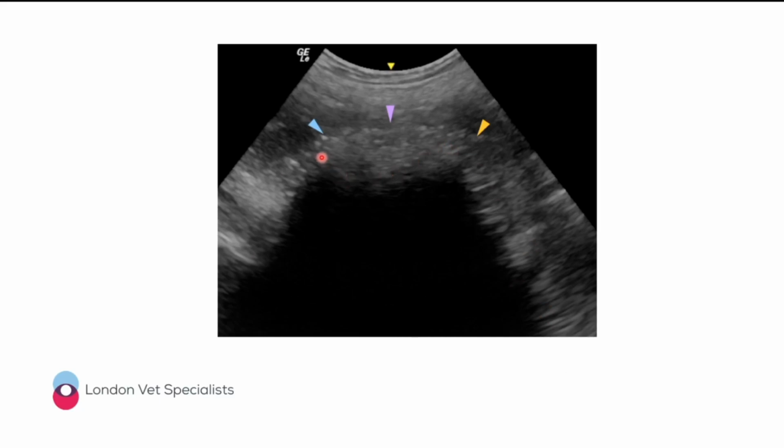And it's this shadowing that really nails it on as a gastric foreign body. So this patient had endoscopy, and we managed to remove a ball, as well as a bunch of other stuff from this dog's stomach, including a mixture of grass and chewing gum, and a whole bunch of other horror that had all stuck together in the gastric lumen and was causing a gastric outflow obstruction.